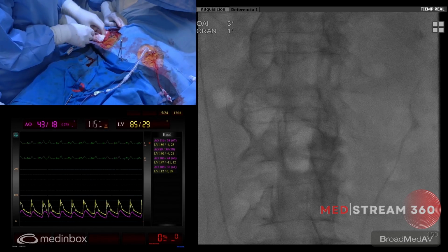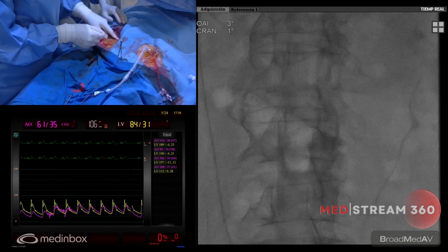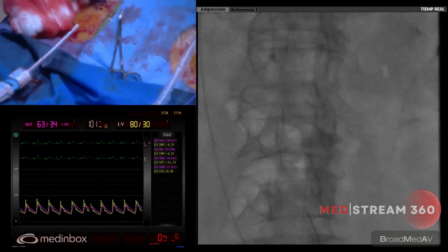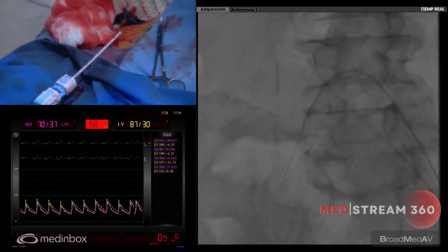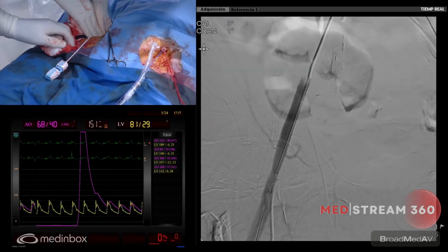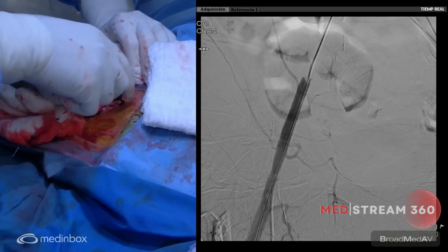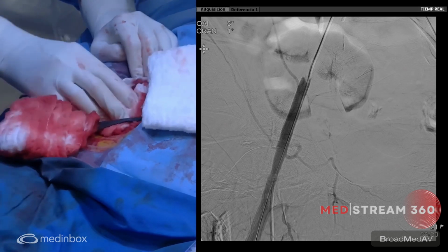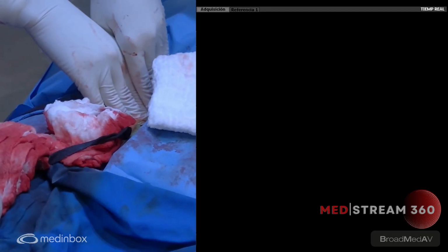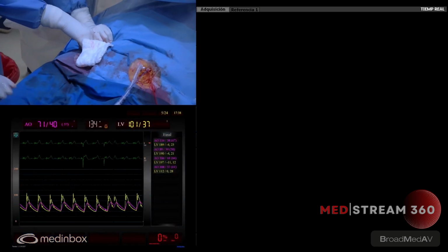We have some oozing, you see with the camera here on the groin, just some oozing, but I will check it and I will inflate the contralateral balloon for some minutes to get the perfect sealing. So the sealing is okay. So we can hold it, move it, light. So I will tighten all the knots and we'll cut it. Okay. Carlos is going to hold the balloon and we can hold the groin. Yeah, the blood pressure is 100. We will hold the groin to get the perfect sealing.